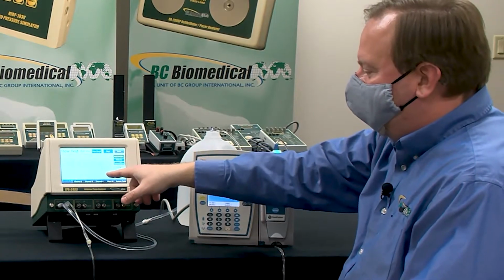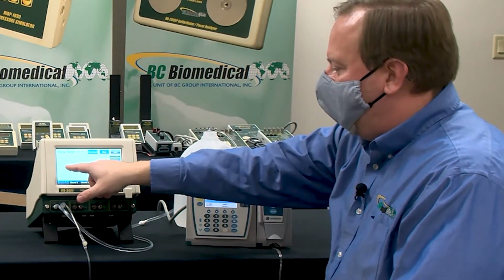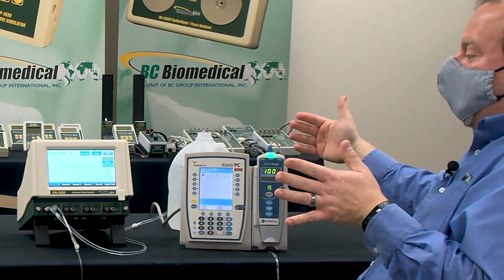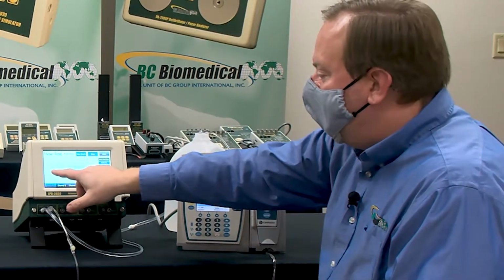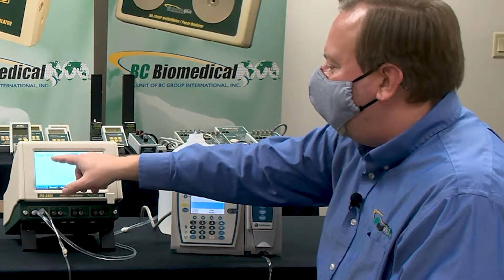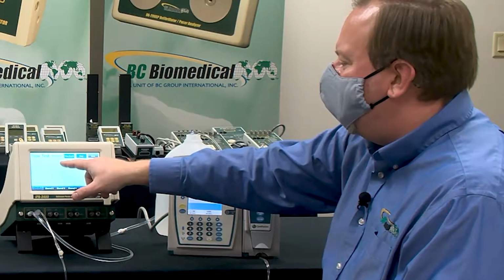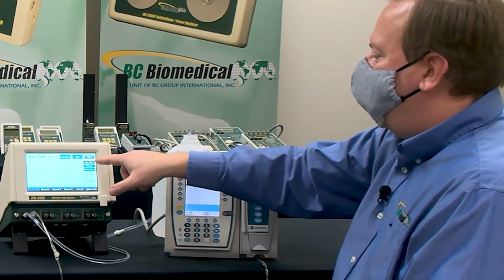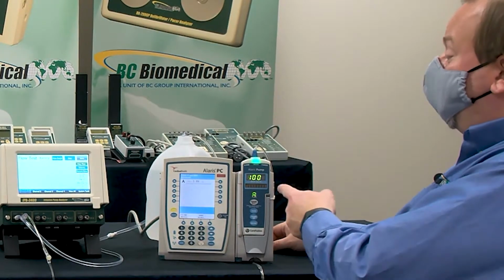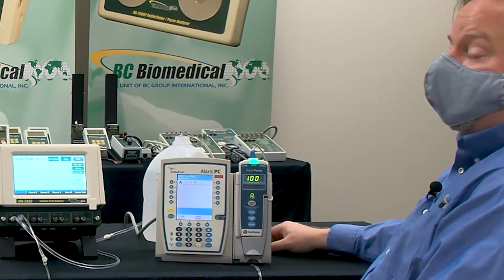Whereas now we can say average and instantaneous. The average flow is how much volume has been delivered over the duration of my test, and so that's a very stable number. Let's just do average. It started off a little flaky, and then as soon as I got a little bit of data in me, now I'm pretty stable. And it'll just sit there. And this pump is pretty good. This is one of the better ones.